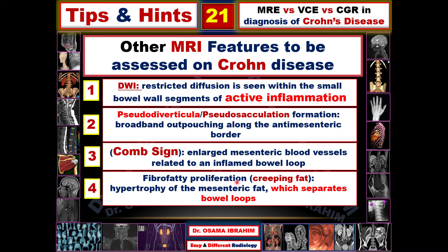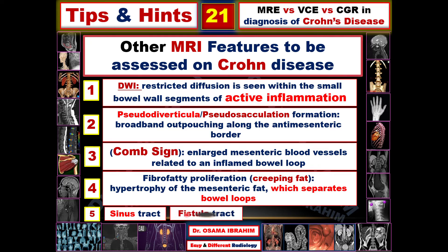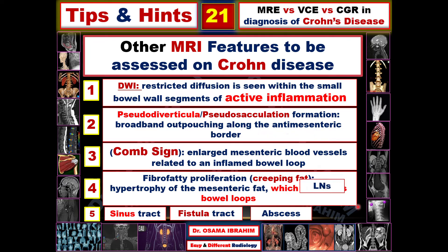Fibro-fatty proliferation refers to creeping fat, appearing as hypertrophy of mesenteric fat separating the bowel loops — separation of bowel loops on imaging confirms this finding. A sinus tract occurs when a lesion creates a wall defect passing beyond the serosa. Fistula formation connects pathologic bowel loops to other bowel loops or neighboring structures such as the urinary bladder or vagina. Abscess formation and mesenteric lymphadenopathy are additional features detectable by MRI.